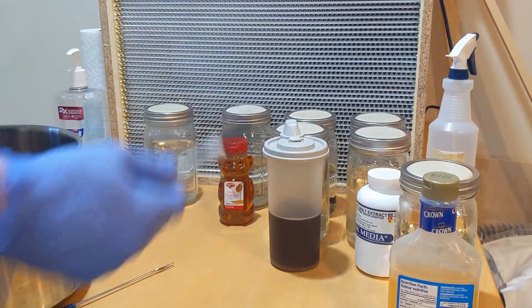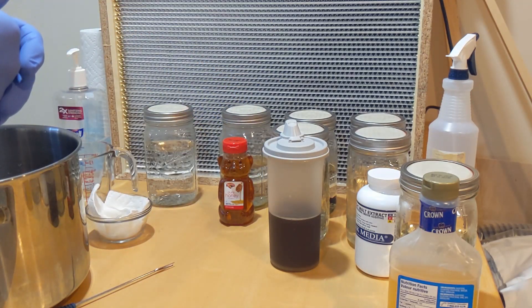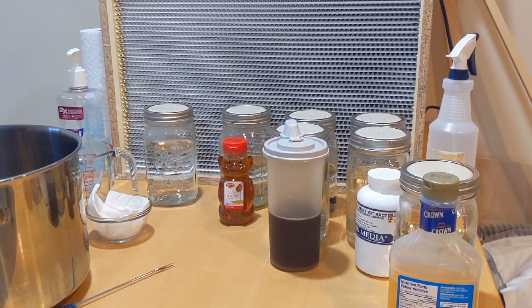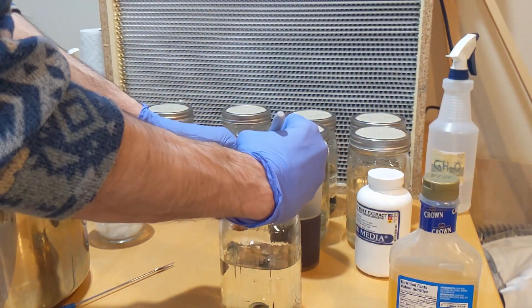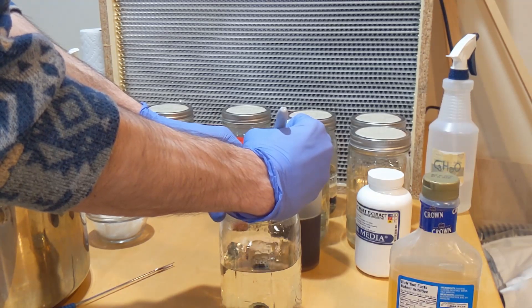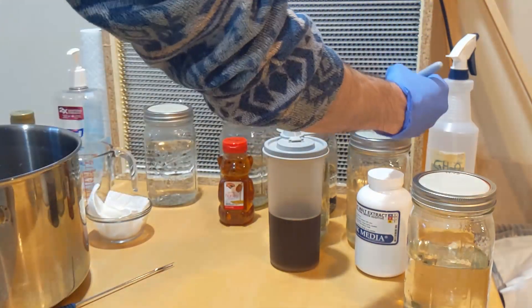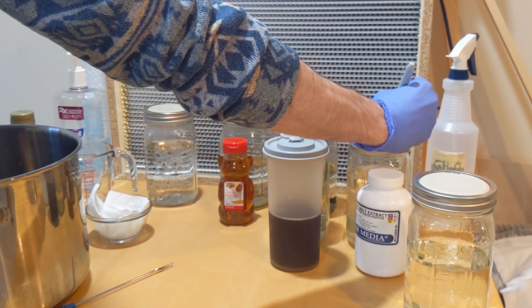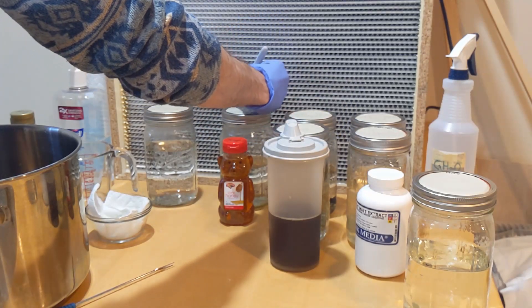Don't worry. So I'm just going to label them really quickly just so I don't mess up when they come out. I think. I'm not going to do the foil on top. I mean maybe I will. I don't know. We'll see. I'll bring them up to the stove and I'll see what I'll do. But I'm just going to write... Karo. And I'll go... Light malt. And maple. And honey.